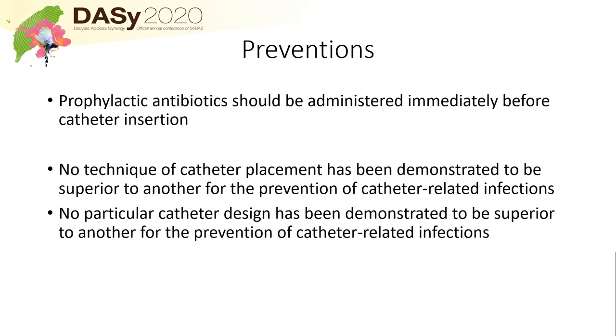To prevent exit site infections, prophylactic antibiotics should be administered immediately before catheter insertion. However, no technique of catheter placement and no particular catheter design have been demonstrated to be superior to another for the prevention of catheter-related infection.